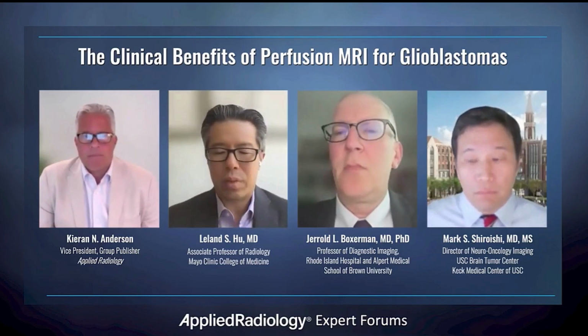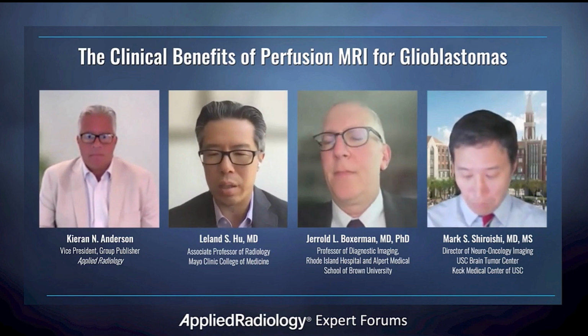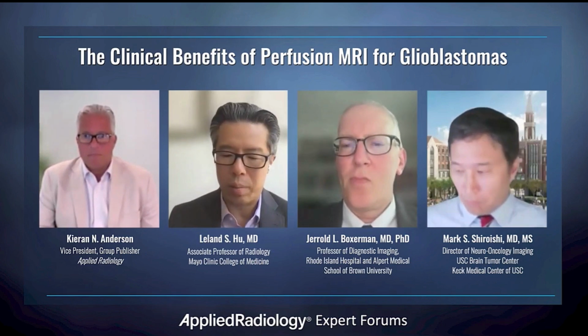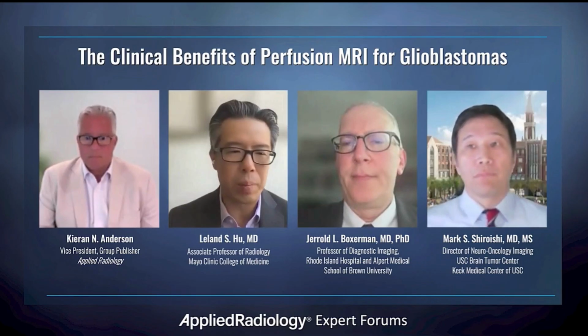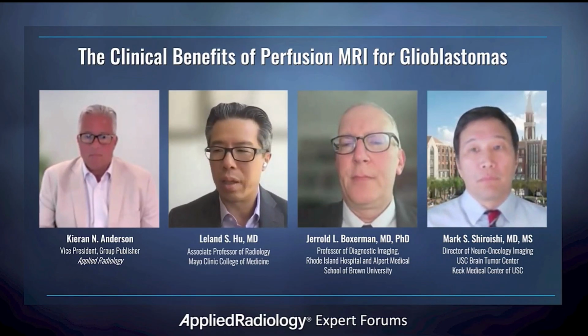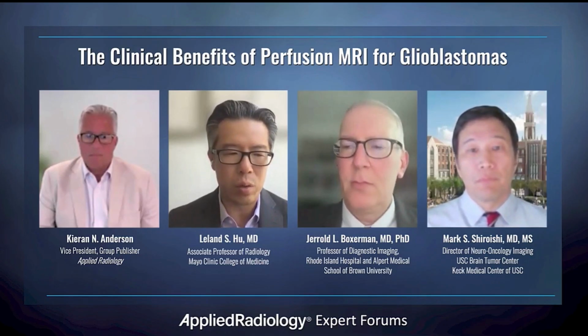Yeah, sure. In terms of the clinical impediments, really what Dr. Shiroishi had brought up about making sure that you're set up for the correct acquisition. All you need really is a power injector, and just awareness, again, of putting in the large bore IV. In terms of acquisition, those are the things that you have to address.